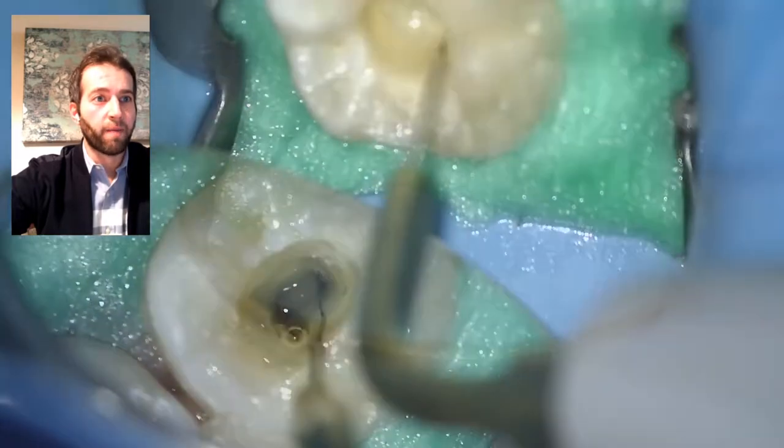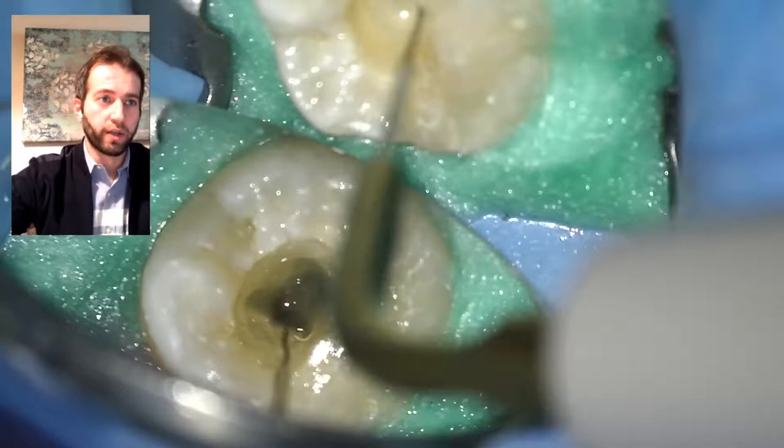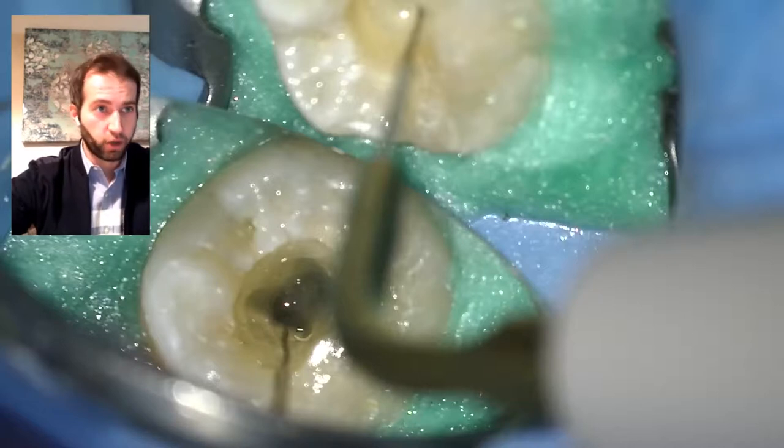This is EDTA — it removes the smear layer. You do it for one minute, or as I do, 30 seconds with ultrasonic activation just to speed things up. EDTA removes the smear layer, which is the inorganic layer that sodium hypochlorite cannot touch because sodium hypochlorite only removes the organic layer. This opens up the tubules for better penetration of your sealer and gutta-percha.